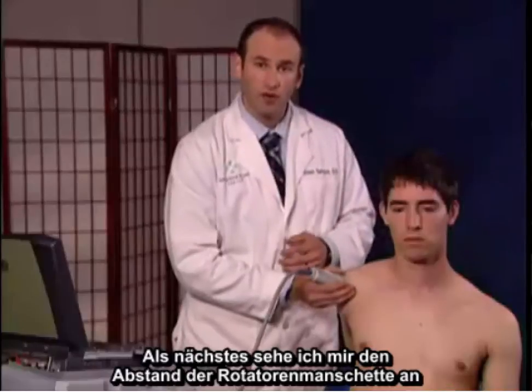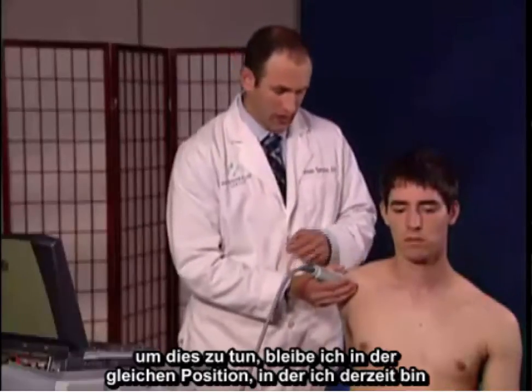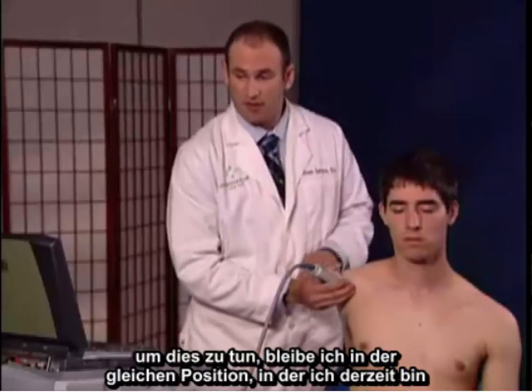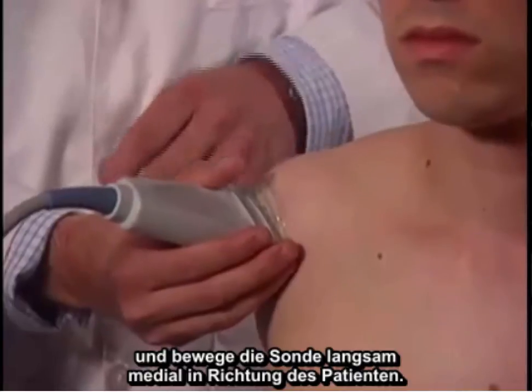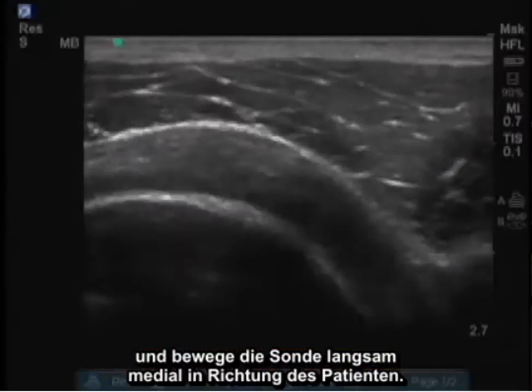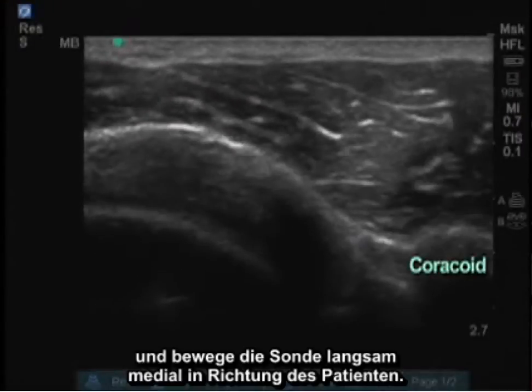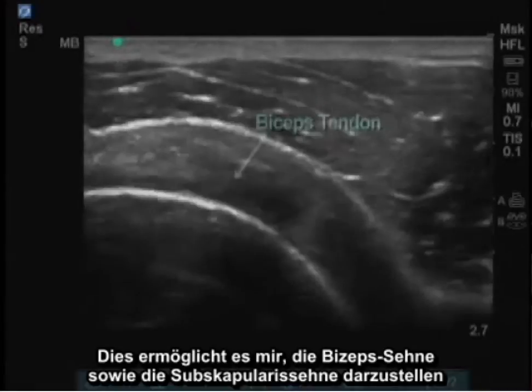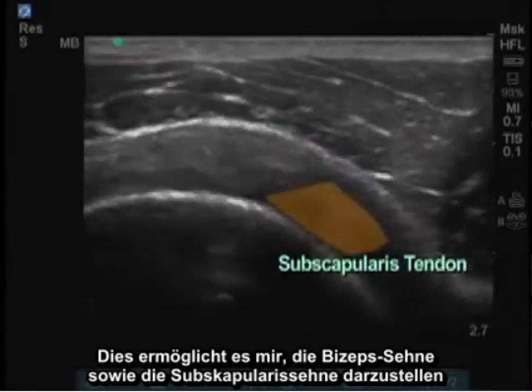Next, I prefer to look at what's called the rotator cuff interval. To do this, I maintain the same position and I'm going to slowly move the probe medially towards the patient. This will allow me to visualize the bicep tendon as well as the subscapularis tendon.